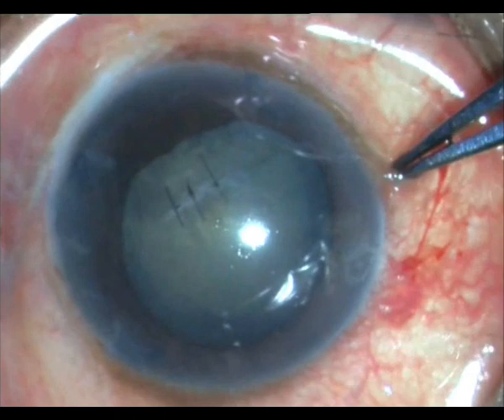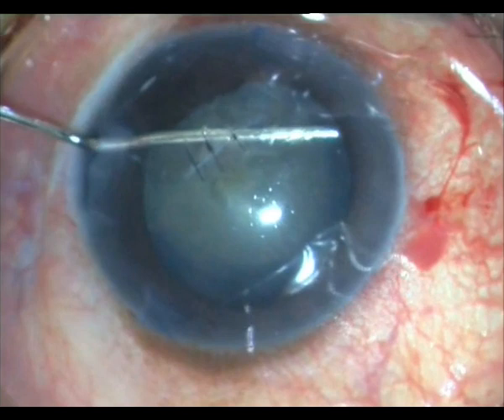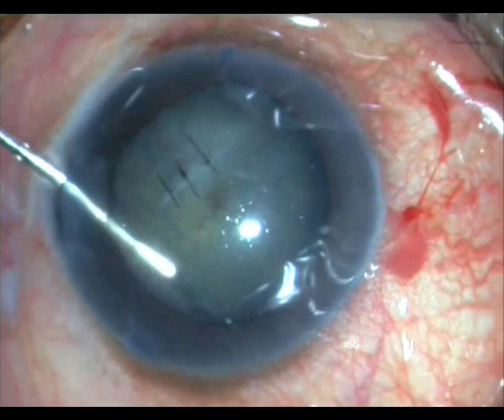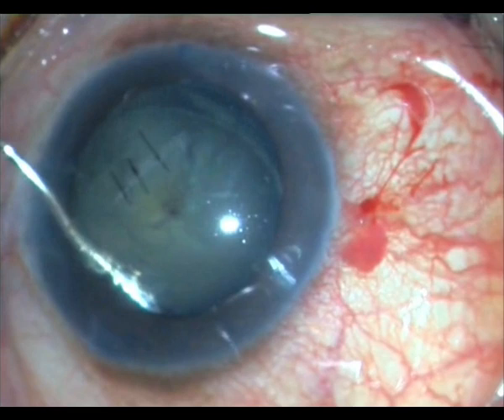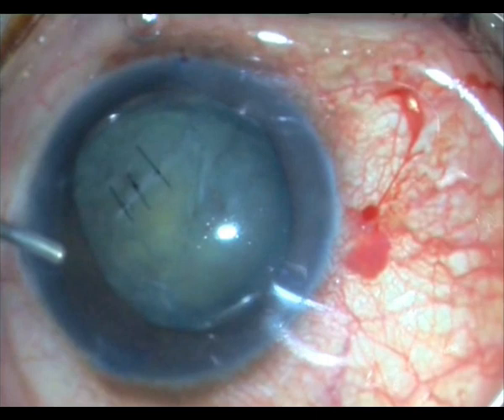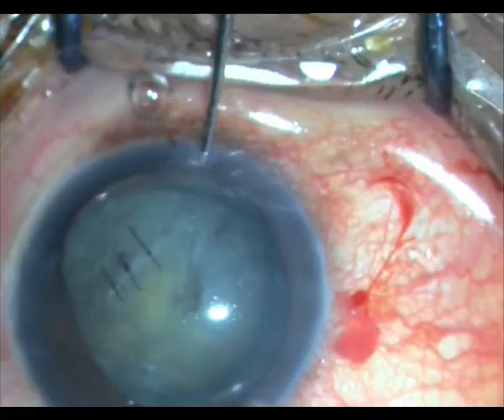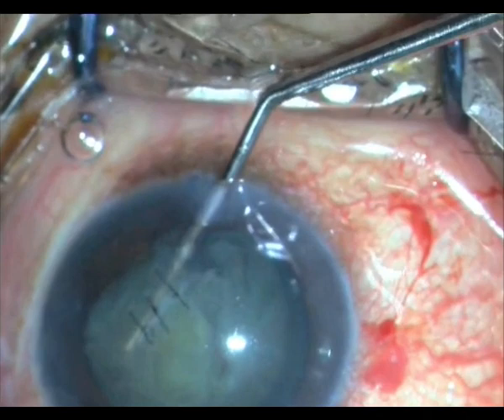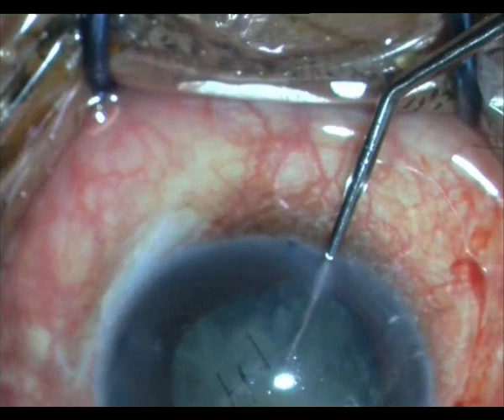I am very careful to decompress the chamber first and then perform hydrodissection. I am very careful because I really do not know if there is any extension to the posterior capsule — it does not look like it. With such a light hydrodissection, the nucleus itself has hydro-delineated and almost prolapsed. I tried to rotate it, but it is too soft, so I put in some HPMC.